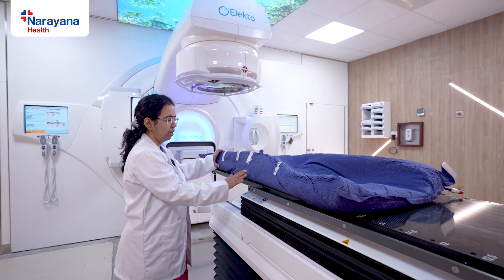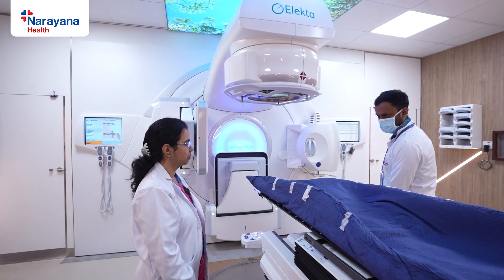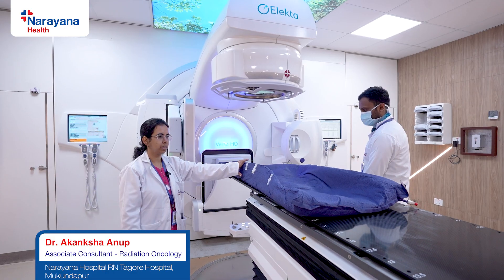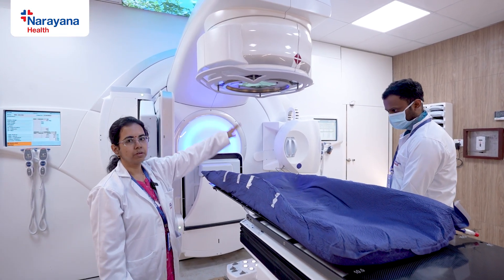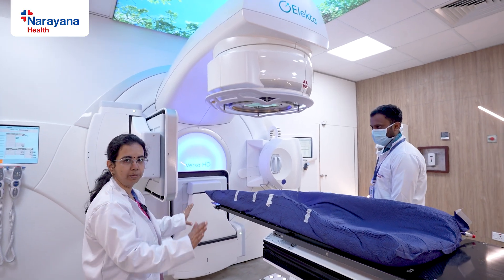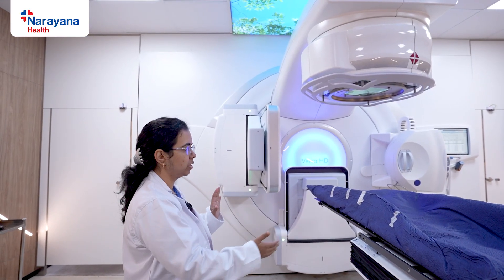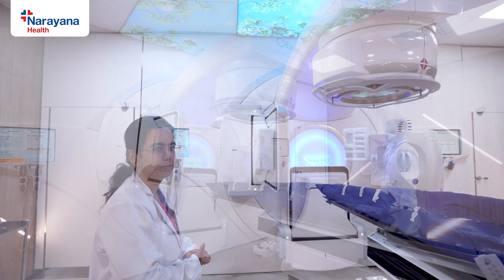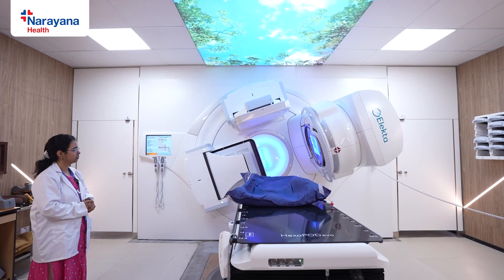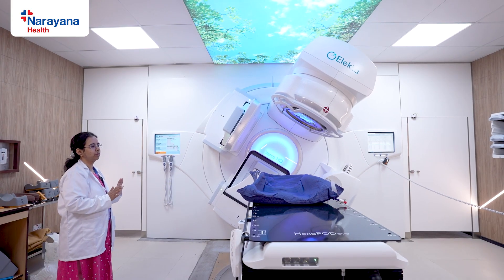We place the vacuum bag on the couch and ask the patient to climb and lie down. Our radiation therapist will show how the couch moves inside. This is the treatment area — for a breast patient, the breast needs to come just below the gantry, which is the treatment head. Once positioned, we immobilize the patient with the help of lasers after matching is done. The gantry moves around the patient to deliver treatment while the couch stays still. The patient has to lie down in this position for 5 to 10 minutes.